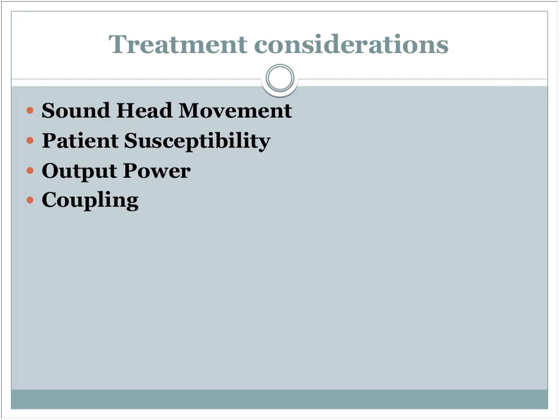So we're looking at cycles per second again, but with a long, easygoing, undulating wave, you're going to be able to bypass a lot of structures very easily. With a wave that goes up and down much more frequently, there's going to be a lot more interference, and you're not going to be able to penetrate as deeply. So the lower the number, the deeper the penetration. And it sounds a little backwards, but that's the way it works.